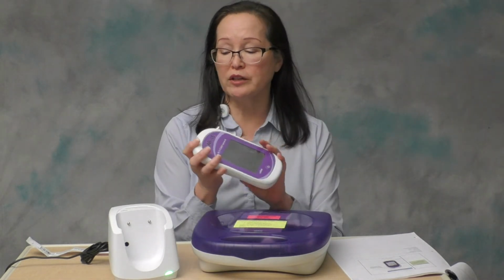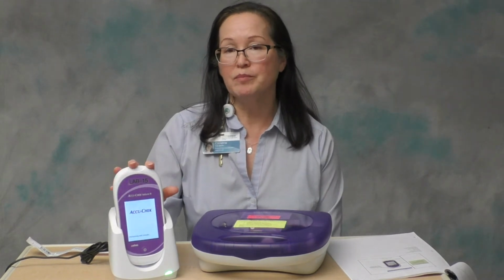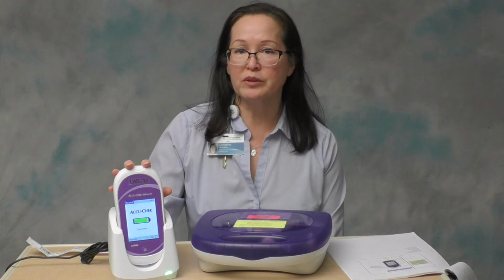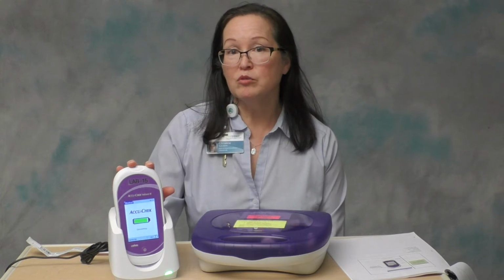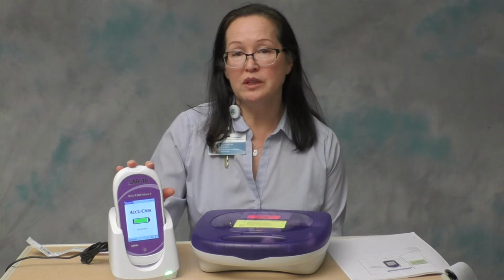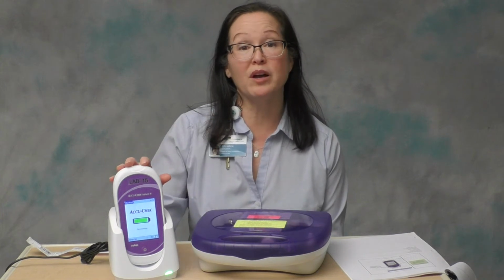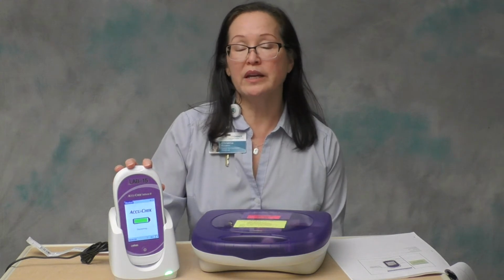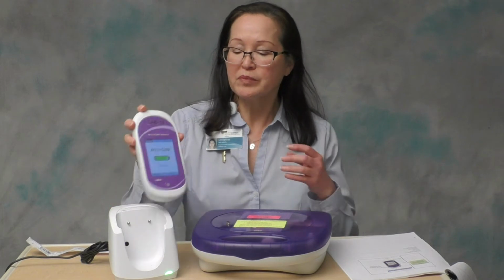If you go to dock the meter and it will not get into its docking screen, reset the meter. It needs to be in its docking screen in order for it to charge properly. So it never hurts to reset the meter. You can reset it as often as you need to. It's like your computer. Every once in a while, the computer processor just needs a reboot. So reset it at any time if it's not doing what you expect it to do.